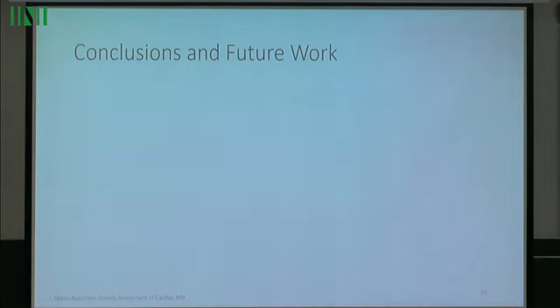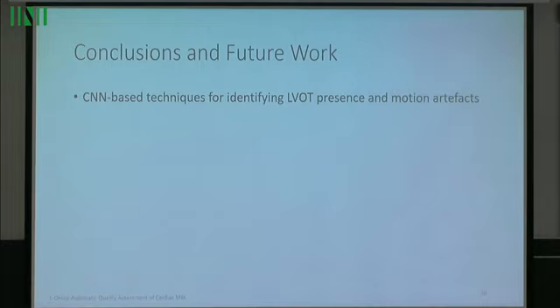To conclude, we have proposed CNN-based techniques for identifying left ventricular outflow tract presence and motion artifact detection. We have shown that novel and realistic data augmentation techniques can aid the performance of the neural networks, such as the k-space based data augmentation scheme.